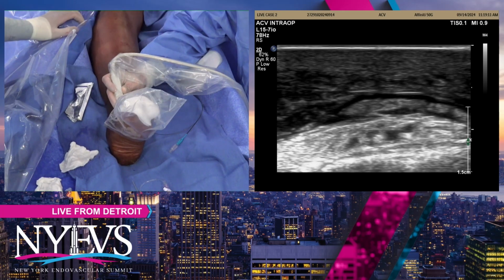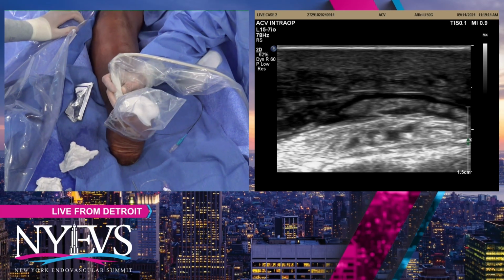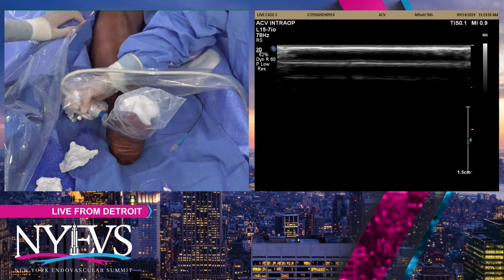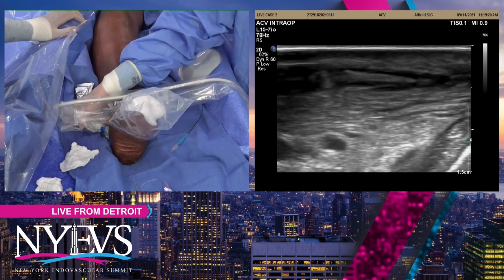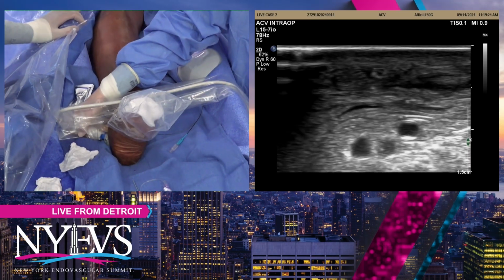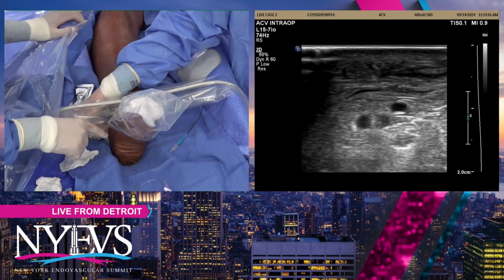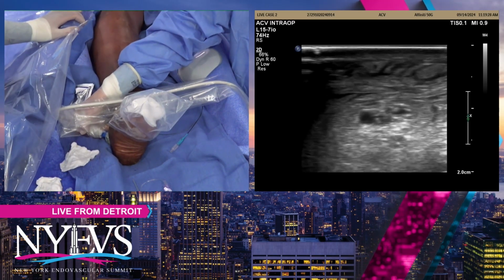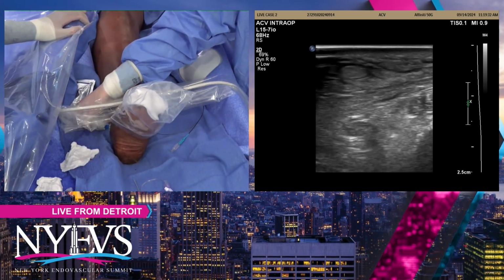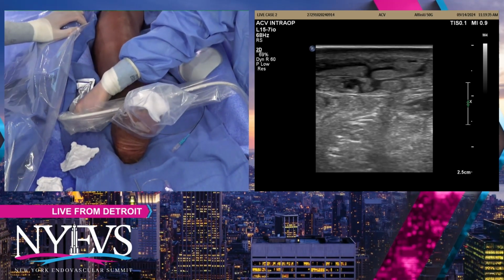That's a great point, Liz. Our interventional ultrasonographer, Kaylin, is by the foot right now. So I want her to show you our posterior tibial artery. She's scanning right now from the foot toward the knee. Go ahead, Kaylin. So she's following, going up toward the knee, and then this happens.